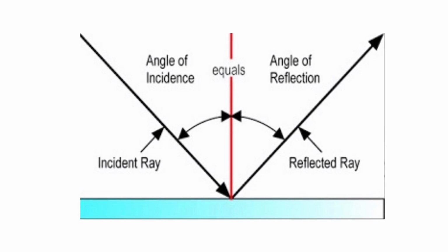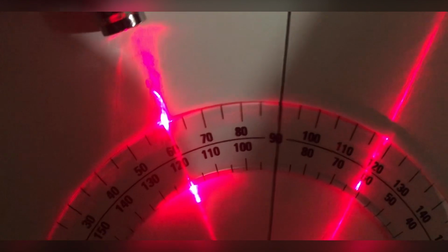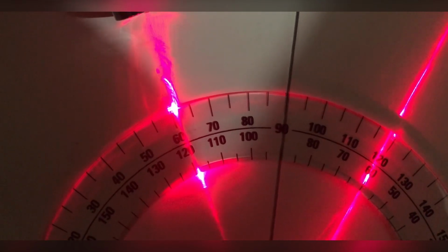When reflection takes place with oblique incidence, the sound beam does not reflect back to the transducer, but instead the beam is reflected in a different direction. The direction of the reflected echo is equal and opposite to the direction of the incident beam.